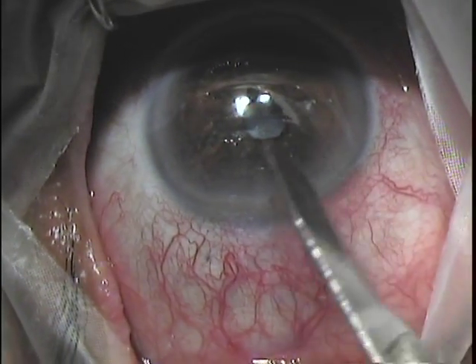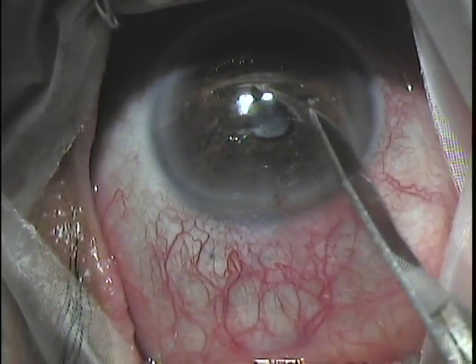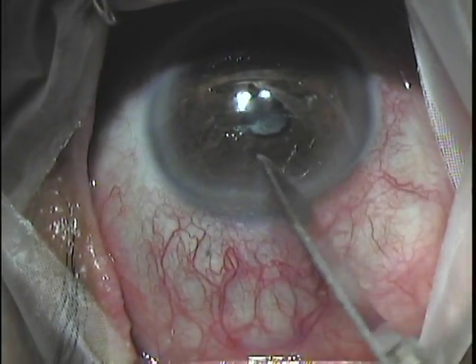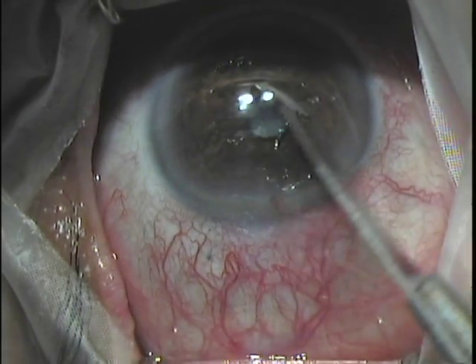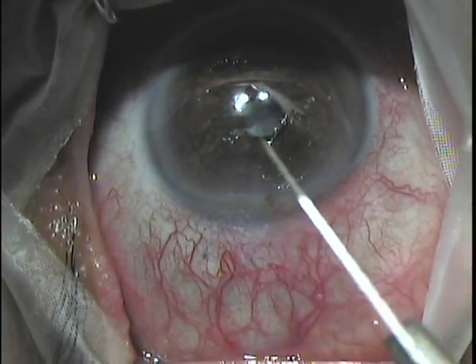Hi, this is John Hovenessian. This video shows the use of the Ambiolens amniotic membrane disc.